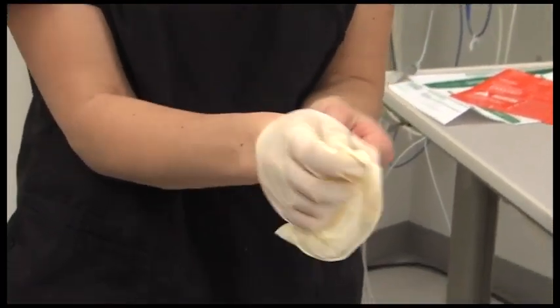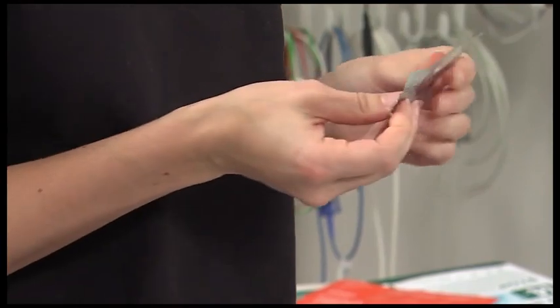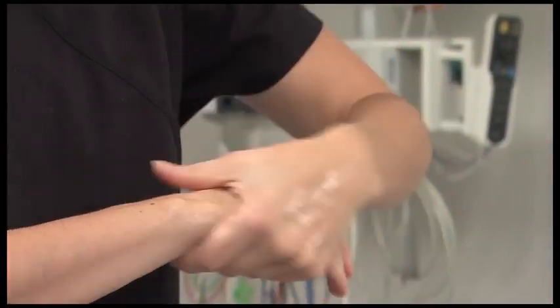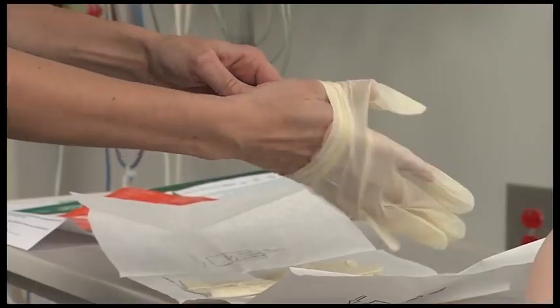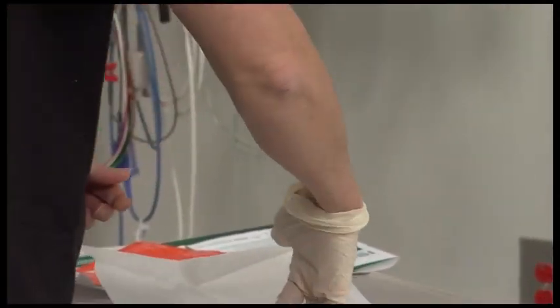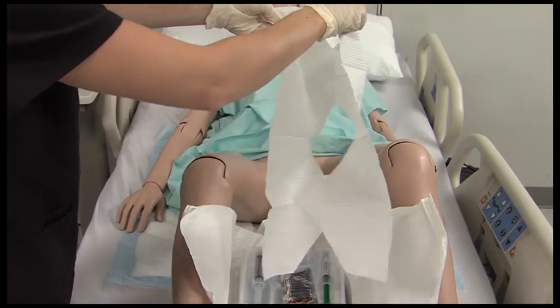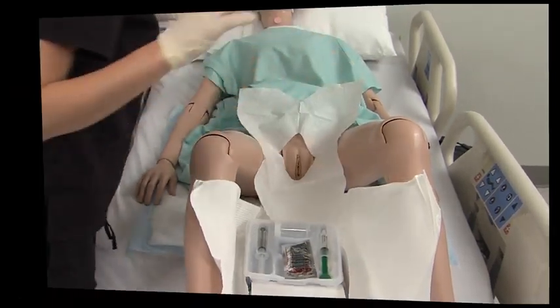Remove and discard your soiled gloves. Perform hand hygiene with the provided alcohol hand sanitizer gel. Open the final fold of the wrap. Don the sterile gloves while maintaining sterile technique in an area outside of the outer wrap. Position the fenestrated drape over the perineum, exposing the urethral meatus. Use caution not to contaminate your sterile gloves.